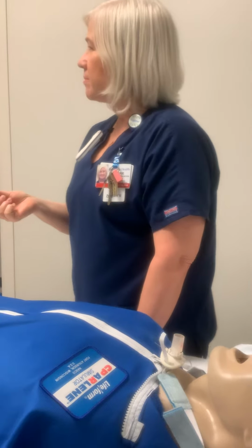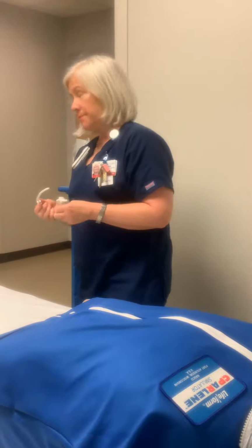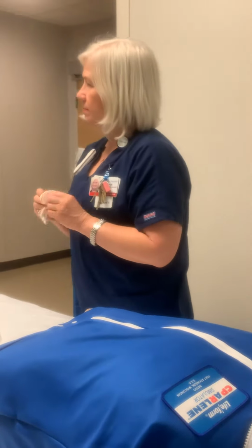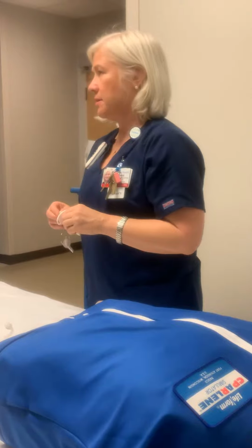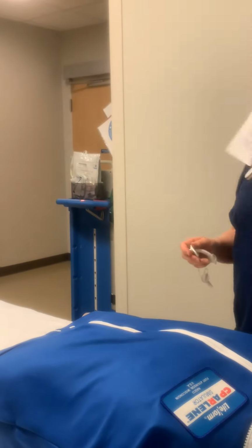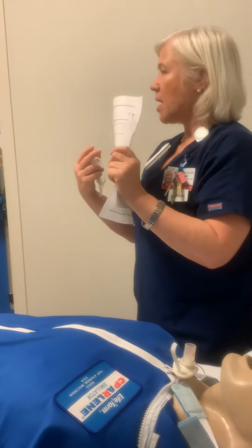So if the patient has a fresh trach, are they supposed to have their obturator with them? Yes, and various sizes too, I guess. I remember this came up when Erica put that together. It was told to us then that the only people who could replace a trach were physicians. Now, if you're a validated nurse, read your policy here at Gateway. The Banner system policy drills down to Gateway: nurses can do it, but they have to be validated.